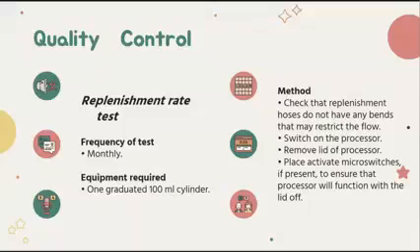So i-check ninyo kung replenishment rate ba ni developer and fixer is the same. Diba? As I have told you a while ago, 60 to 70 ml for the developer and 100 to 110 ml for the fixer. So equipment required is one graduated 100 ml cylinder.